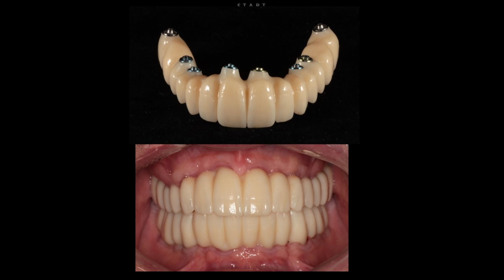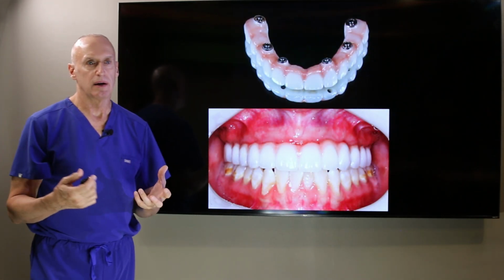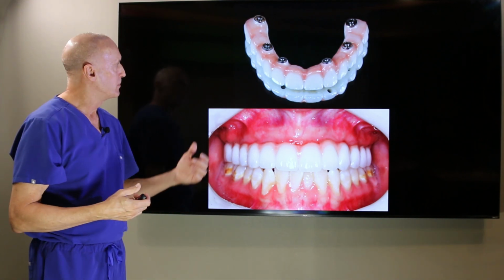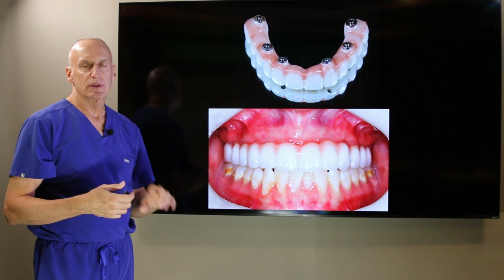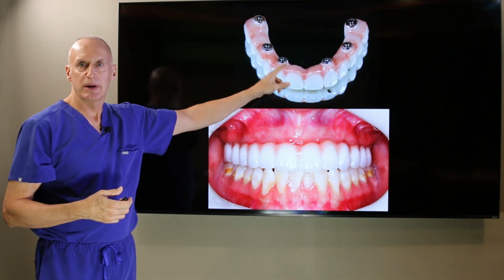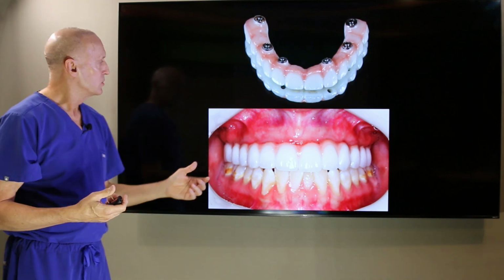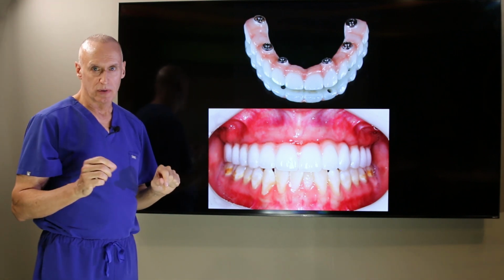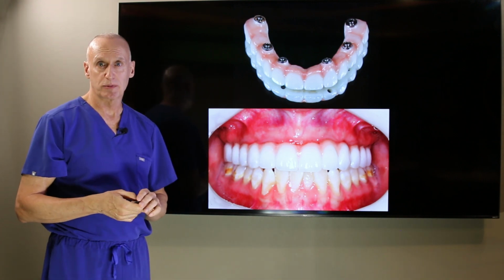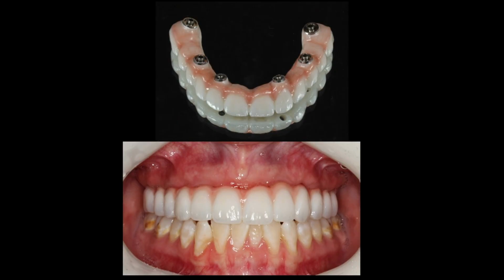That's by the definition of Dr. Misch. There is a caveat to that. There is a slightly in-between classification. I'd call this maybe FP2A, where the patient came in with a little bit of bone loss, and we had to put some pink porcelain in there to keep her teeth from being really long. So it can happen with minor bone loss, or it can also happen if your papilla, the little pink triangles between your teeth, are gone. You may end up with an FP2.